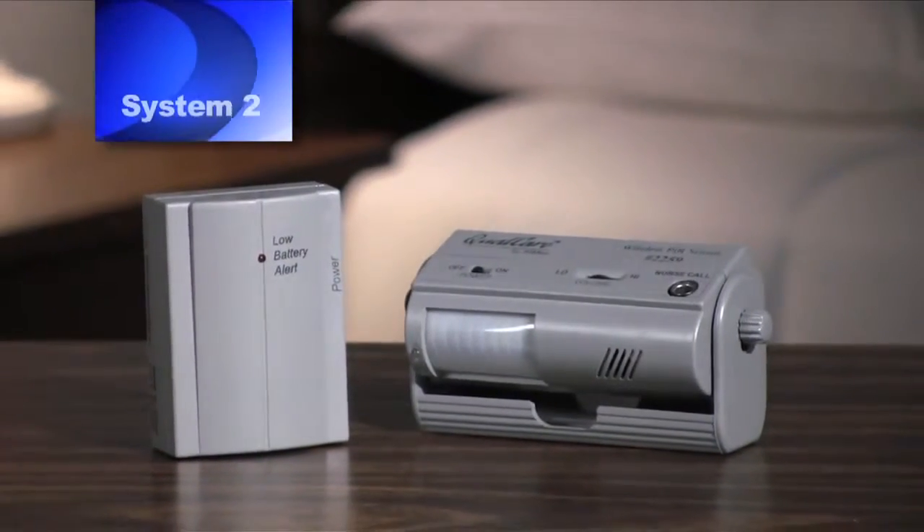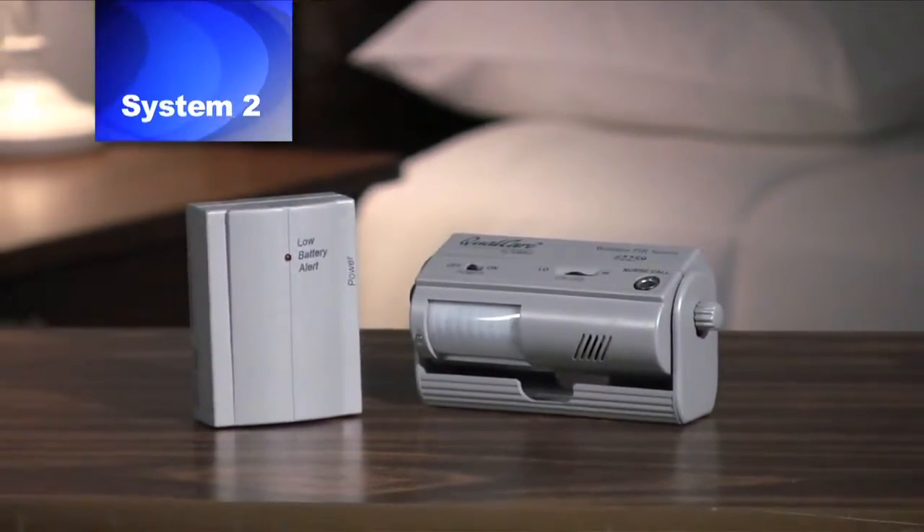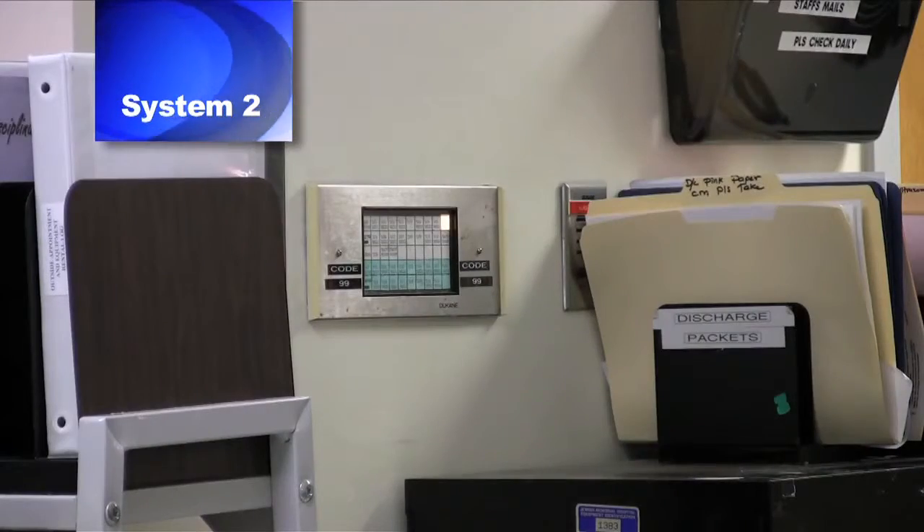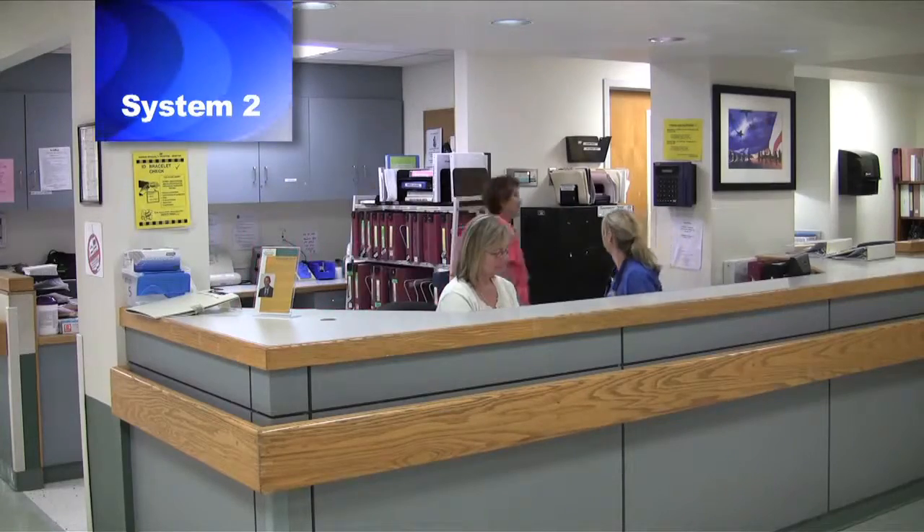System 2 is an upgrade of System 1, including both a sensor device and a nurse call receiver that allows the alarm to sound at both bedside and at the nurse's station. For more detailed instruction on System 2, please see video 2.